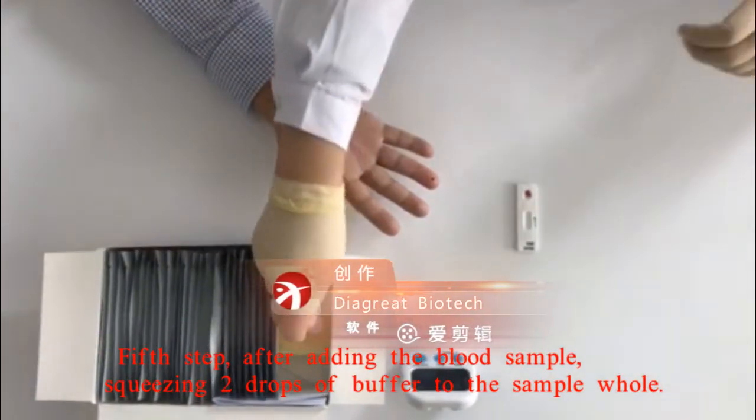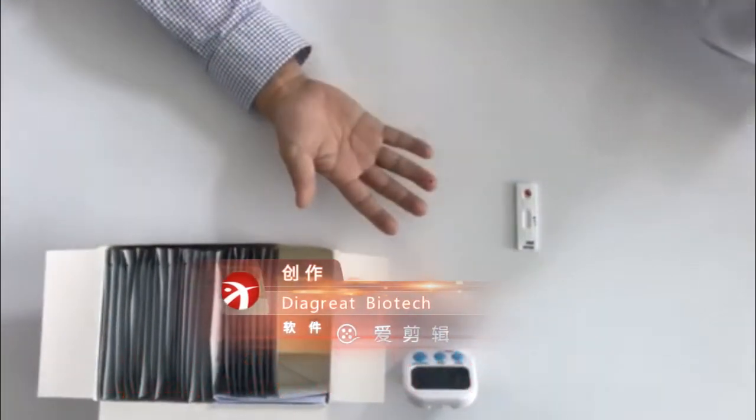Fifth step, after adding the blood sample, squeeze 2 drops of buffer to the sample hole.